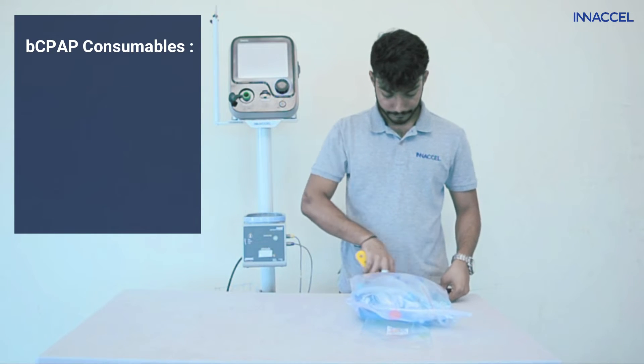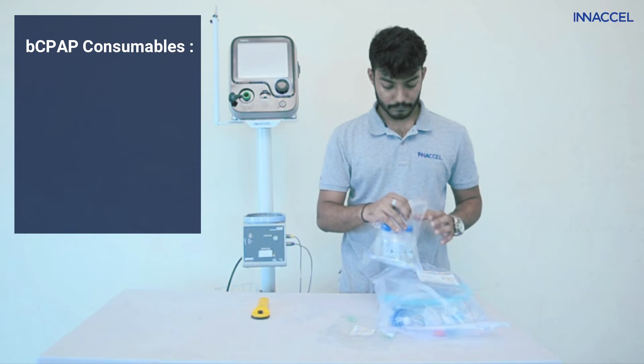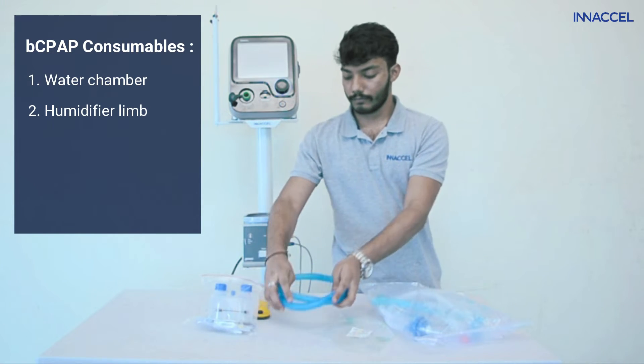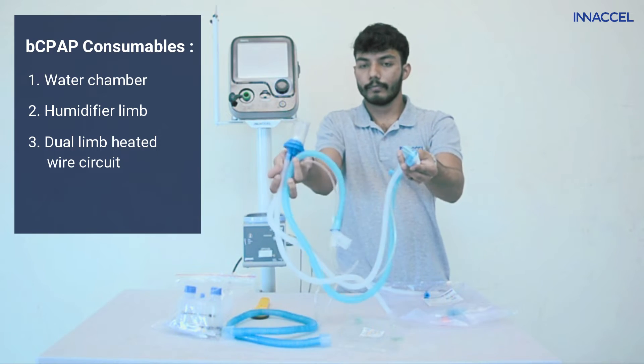You will find the following components inside: the water chamber, humidifier limb, dual limb heated wire circuit, and RAMS cannula.